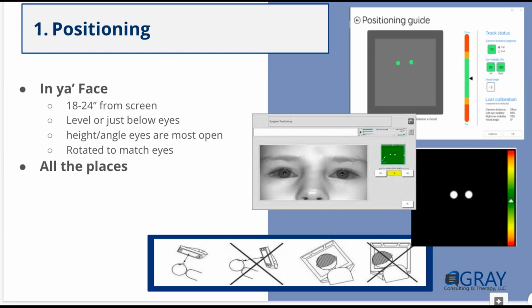The other thing that's really challenging is that the eye gaze device needs to be tilted level with the person's eye on that rotation as well. And so a lot of Good Samaritans or users themselves don't want their device angled because it looks weird or it triggers our OCD tendencies.